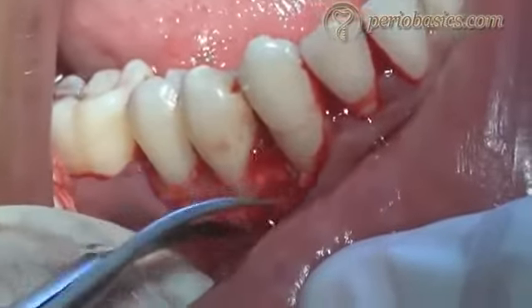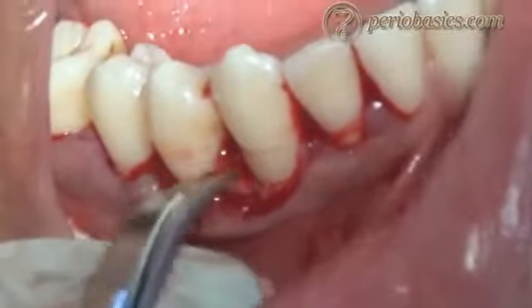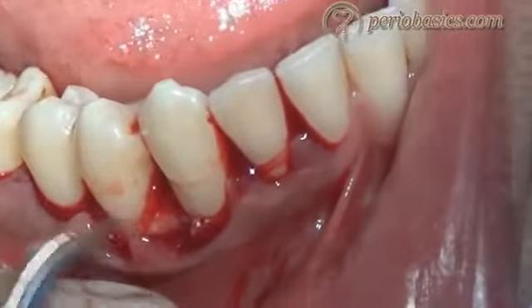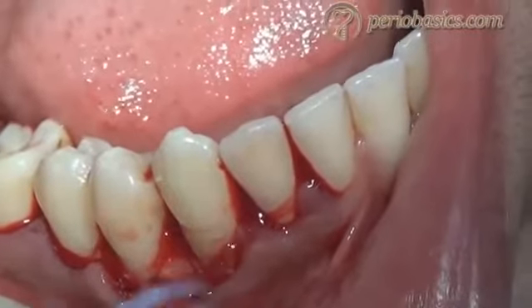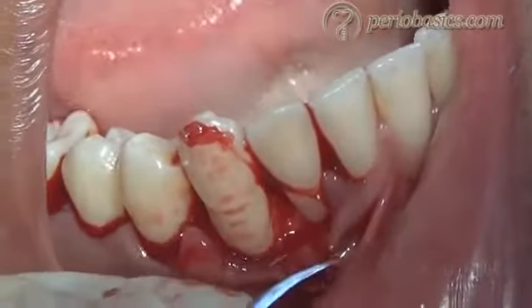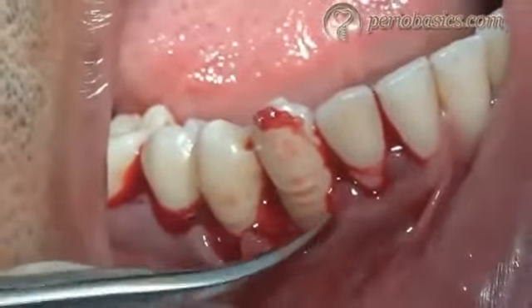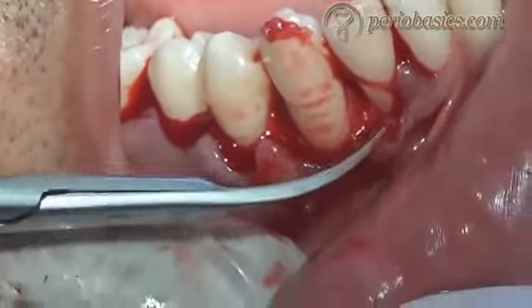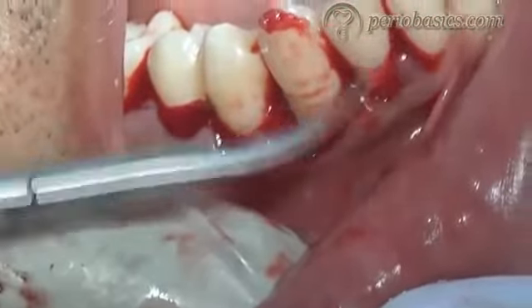So you will see that from the inner surface of the flap we are removing the granulation tissue and all the tissue tags. With the help of curved scissors or Castroviejo scissors, you can remove the granulation tissue from the inner surface of the flap.